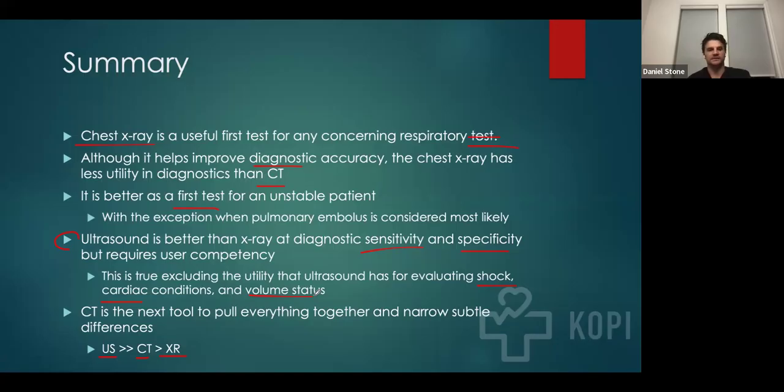It increases incidental findings. So just know that if you see incidental findings noted on a radiology report, that happens with CT, and we know that has increased lifetime cancers across the United States, because we've been irradiating people more, mostly because of incidental findings.